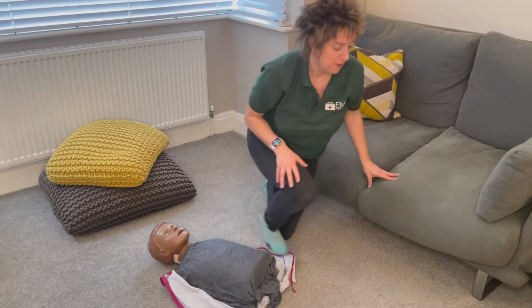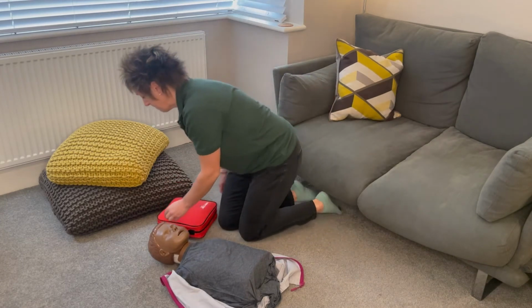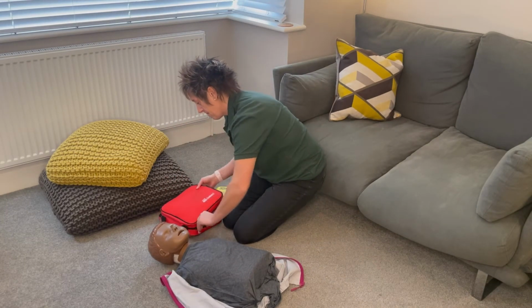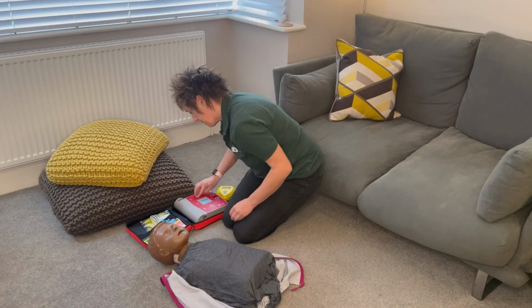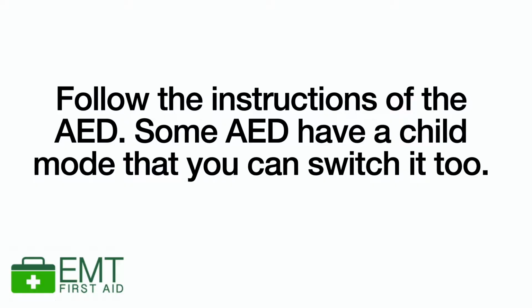After a minute, if this casualty hasn't woken up and I'm still by myself, I'm going to leave them to go and make a phone call and to grab the AED that I have available. I will come back and I will turn the AED on. Apply pads to the patient's bare chest.